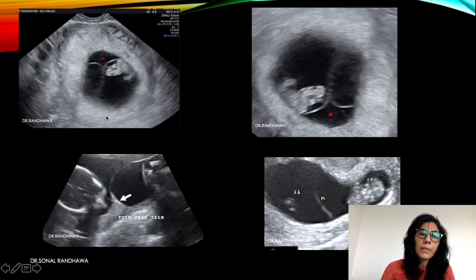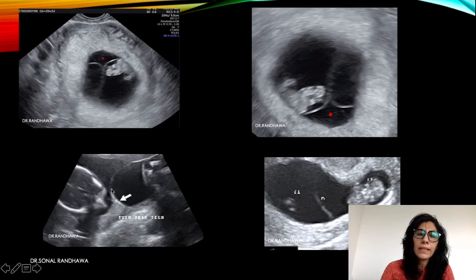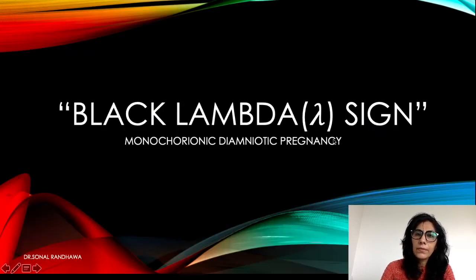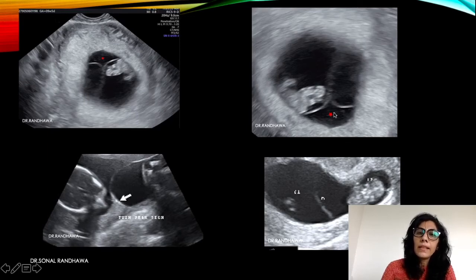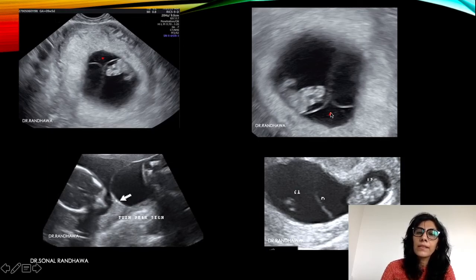Why does it look like lambda? The picture has been inverted here to compare. The Greek letter lambda is shown: the shape is still there, but the area in the middle is black. Why? Because the single chorion stops placental villi from growing into that portion, so the area remains black.